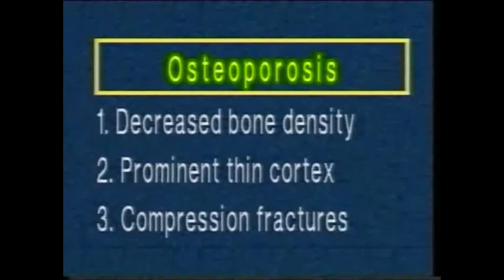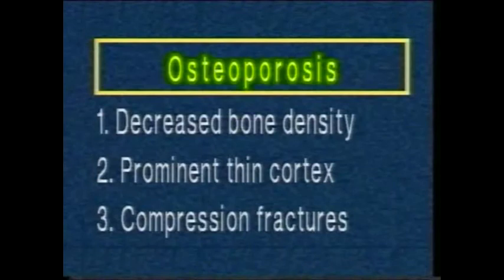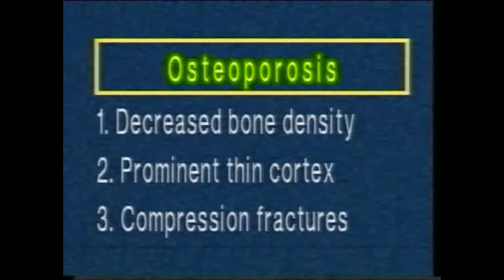The radiological features of osteoporosis are osteopenia, or decrease in the bone density, with loss of trabeculae. There is a relative prominence of the thin cortex, and compression fractures are common.